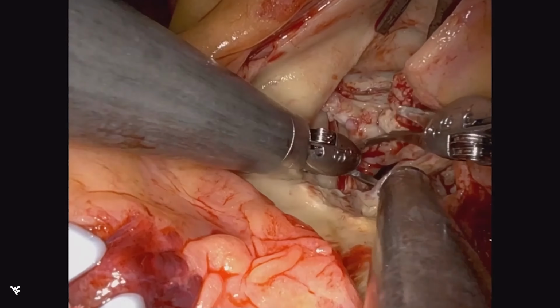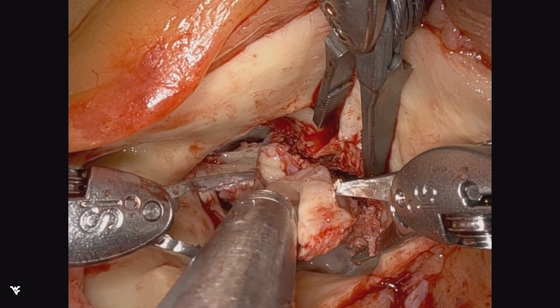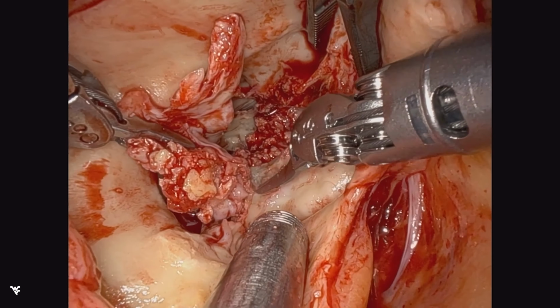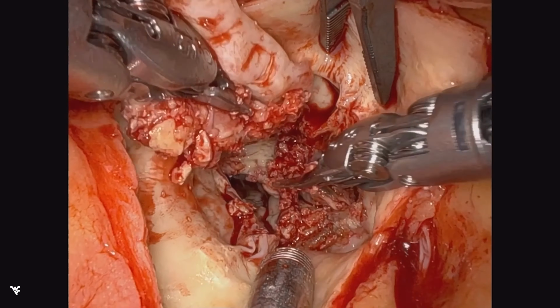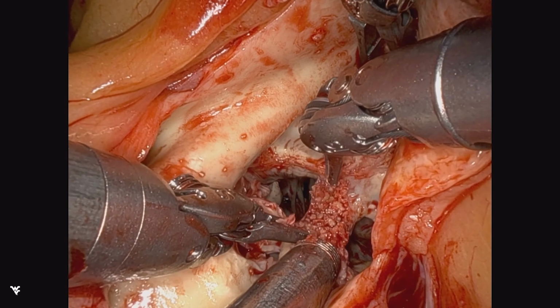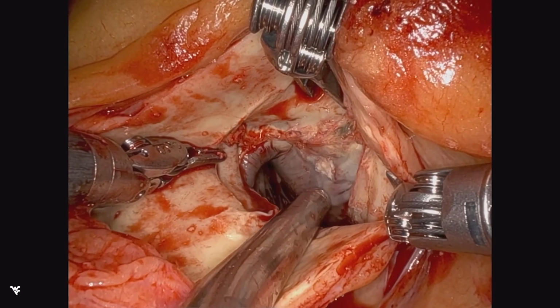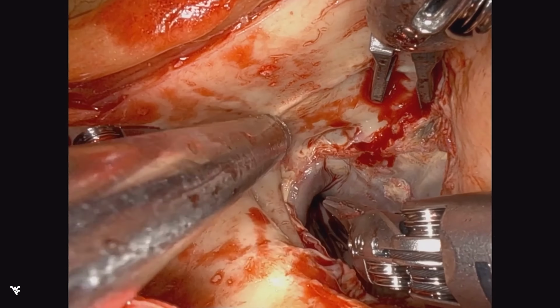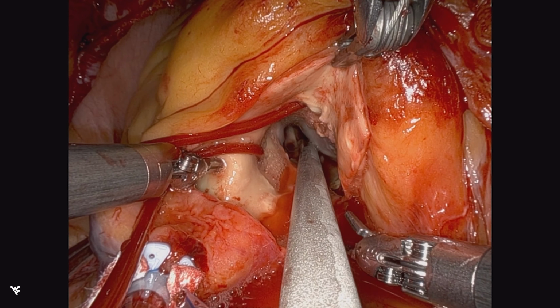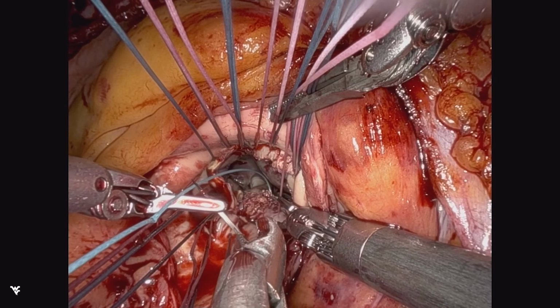And we've got one leaflet out, and now we're getting into the non. And finalizing here into the left ventricular outflow tract. And I think if you can get this flush, it really helps with the overall performance and avoiding left ventricular outflow tract challenges post-replacement.